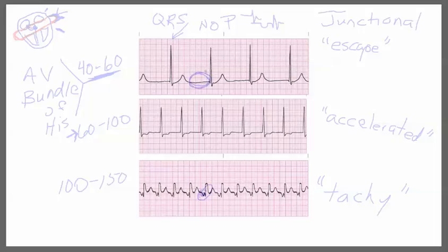When comparing these strips, we're going to look at the rate. The rate on the first one is 40. On the second strip, counting the complexes gives us about 80 to 90, give or take.